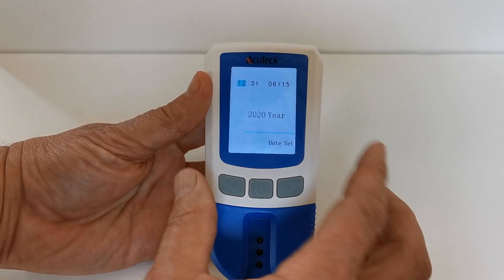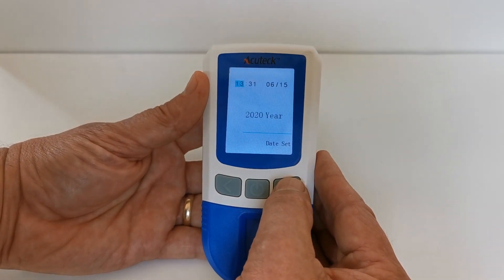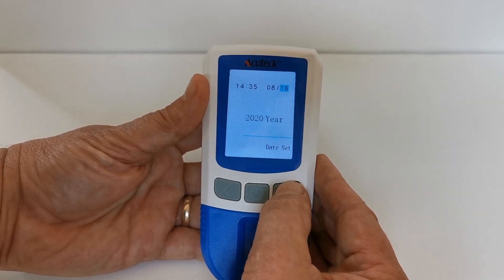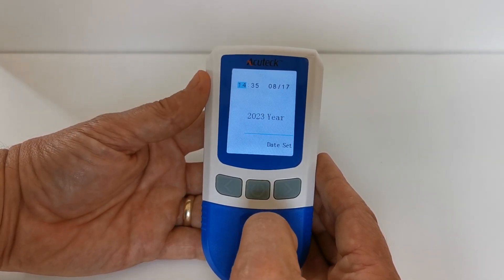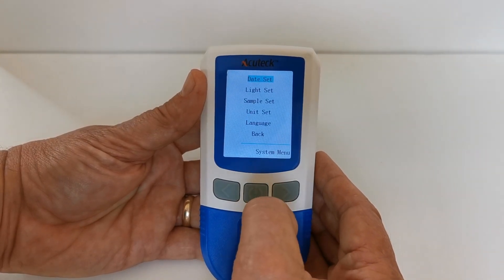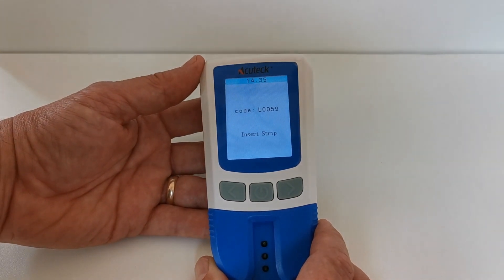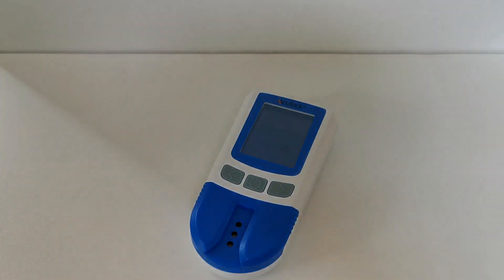Now we have time, month, day, and year. Navigate through these, changing the time, the minute, the month, the day of the month, and the year. When you're happy with the correct time and date, hold the power button down to come out of that menu. There we've got the correct time showing 14:35, and we've set the day, date, and year so the memory will record the correct time and date for each test result.